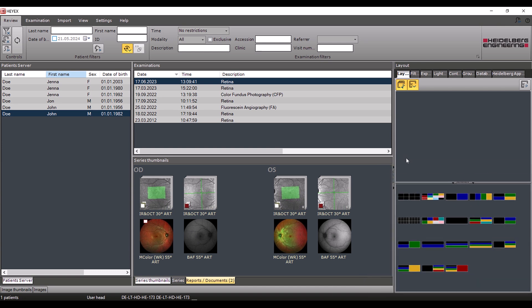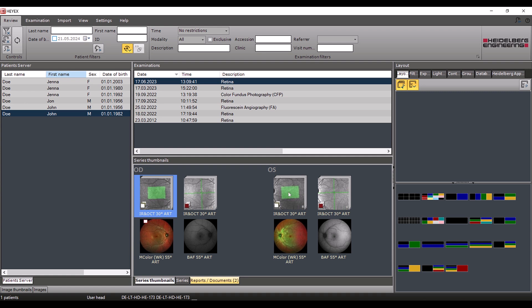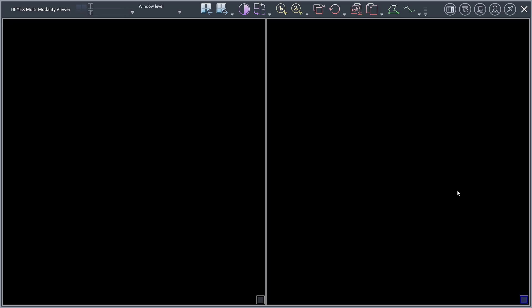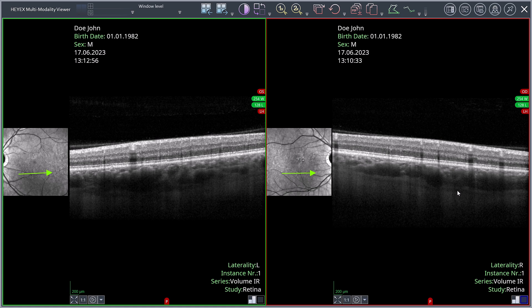In the series thumbnail section, select the images that you want to view simultaneously while holding the control key — for example, the OCT volume scan of the right and left eye. Drag and drop both images to a layout with different coloured viewports. The Multi-Modality Viewer opens.